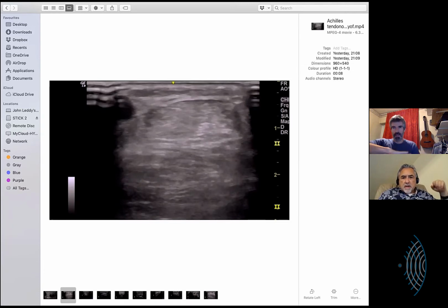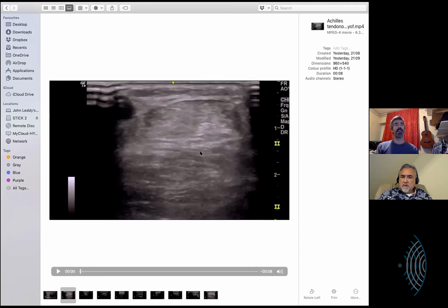So you roll it out, it becomes a very flat but quite thick piece of aponeurosis. And then beyond a certain point, you actually see a filament between it, a nice bright line between the two layers. And the soleus layer is much thinner, typically, but is quite clearly visible. And that's how you pick out your plantaris tendon.